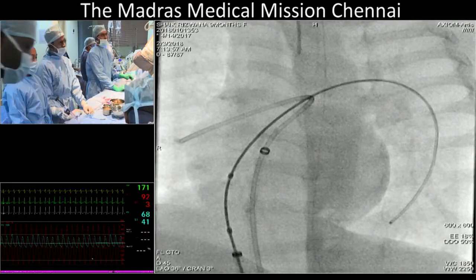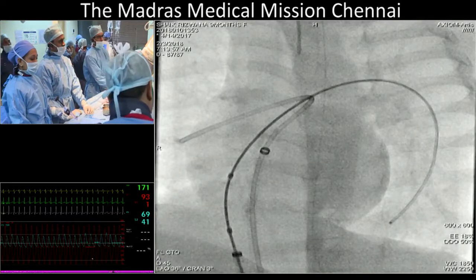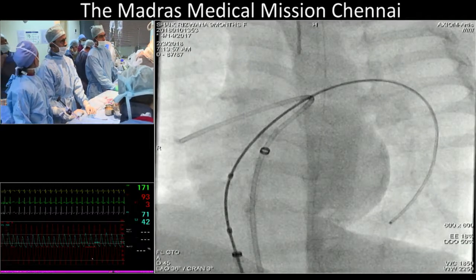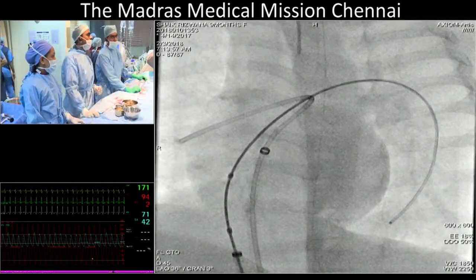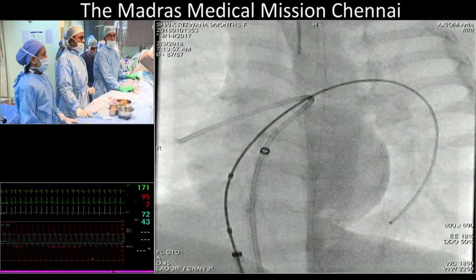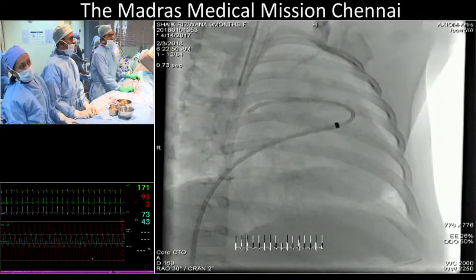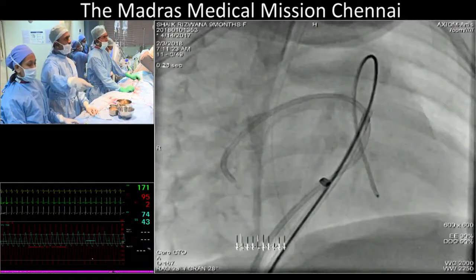Siva, on the echo, I thought, we don't see any moving pictures yet. Can you show the movie? Siva, I remember from the echo that there is a membrane in the LPA. Is that the one, or is this the one with the membrane?